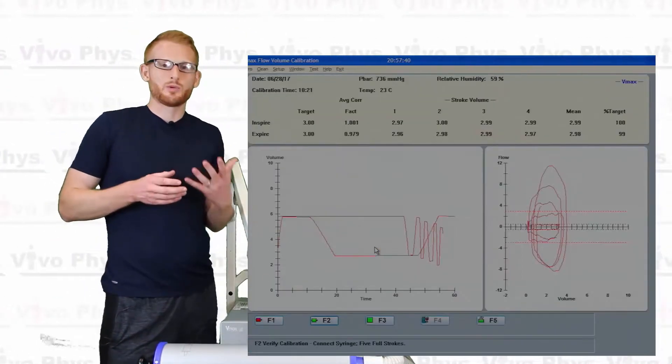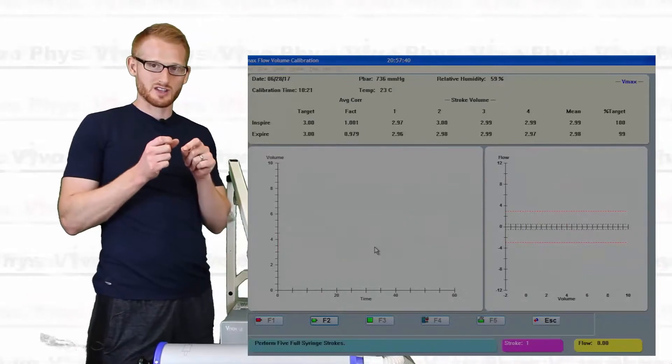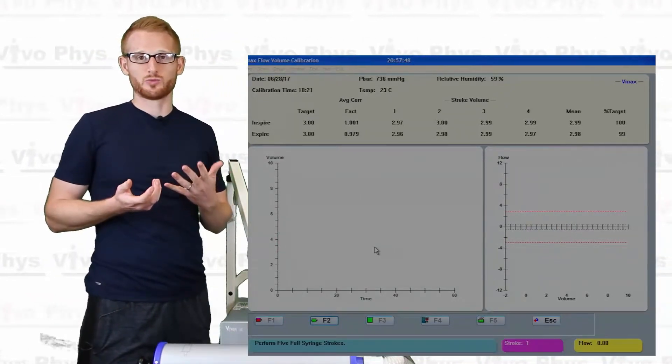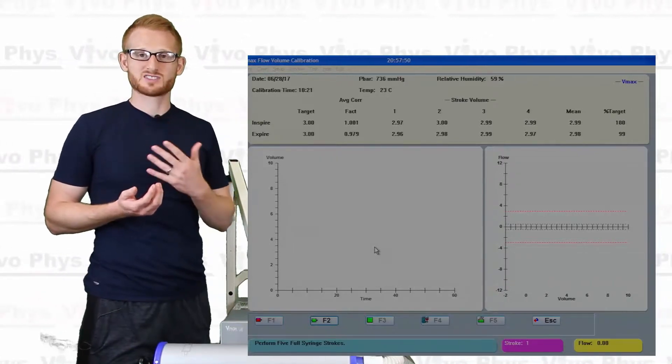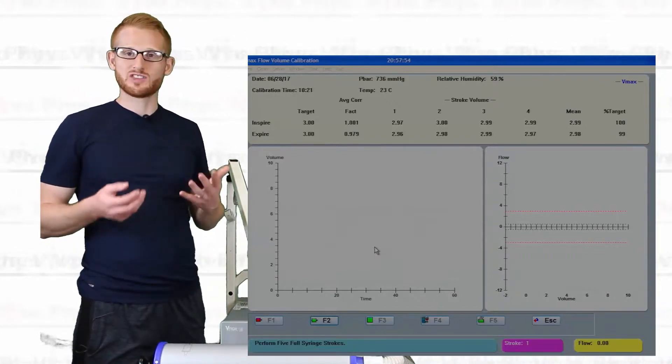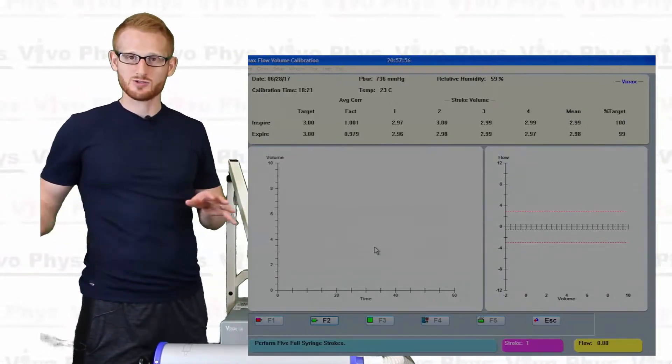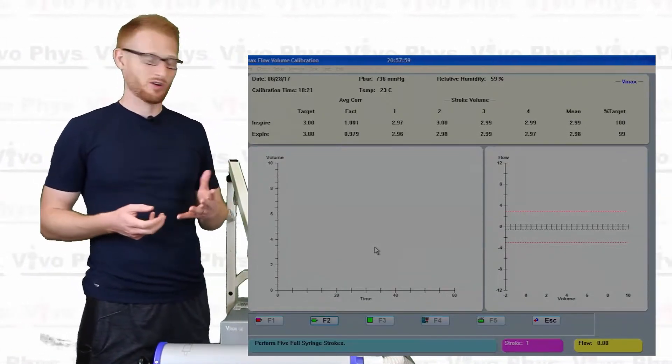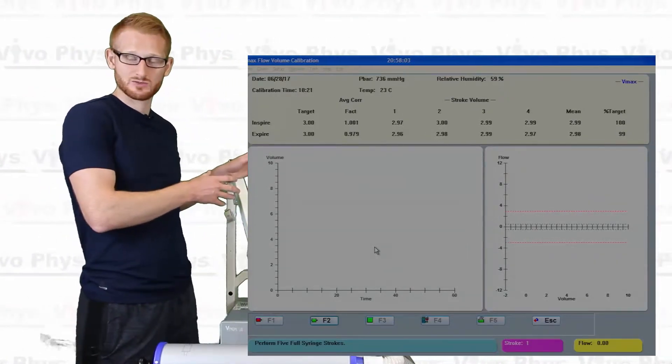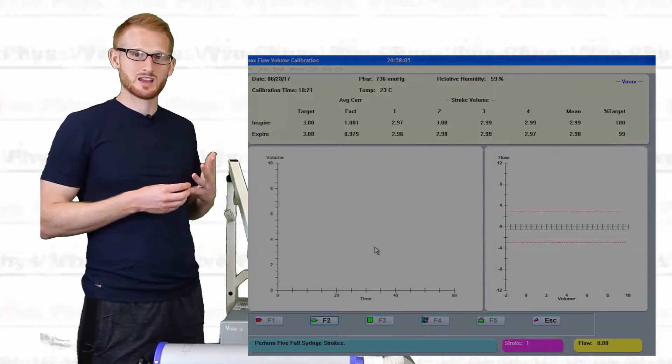Alright, so you can see there it took me a couple extra tries because a couple of those inspirations and expirations didn't go into the range as much as what the system wanted it to do in order to use that as a calibration. Alright, so but once you get them all, so you can, if you fail that's okay, you just keep going and trying until you get them all. But once you get them all, it's going to pump you, push you into this window here and you're essentially going to do the same thing again.